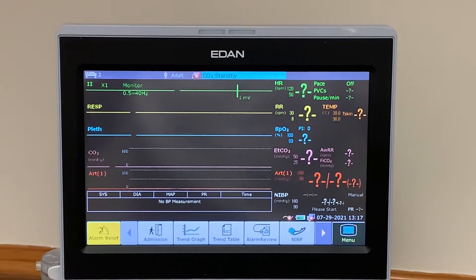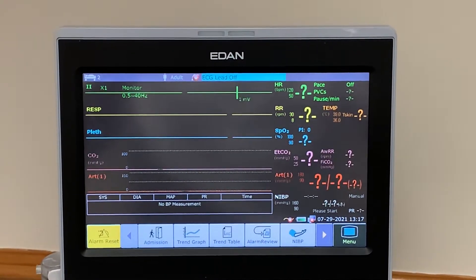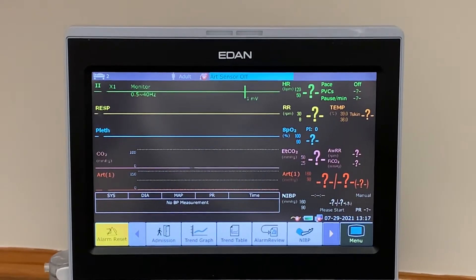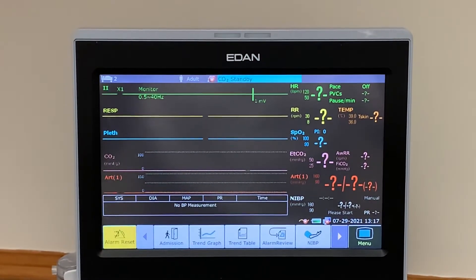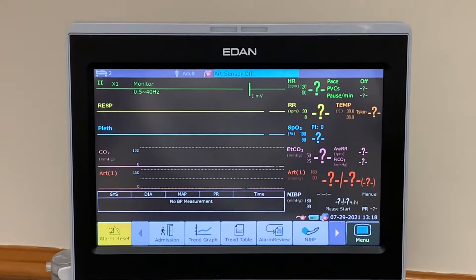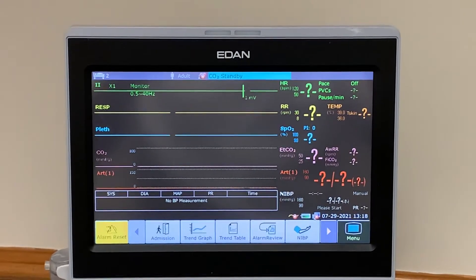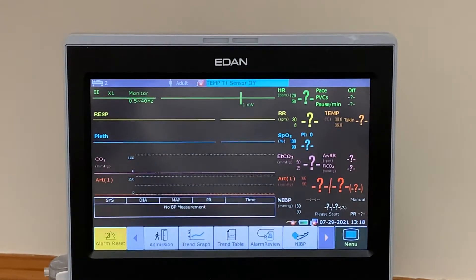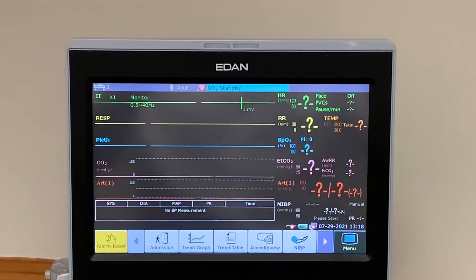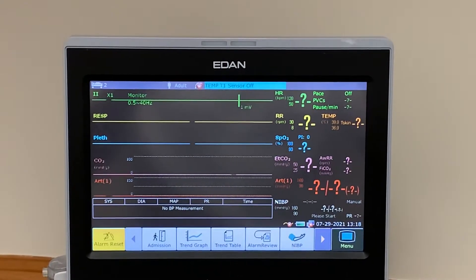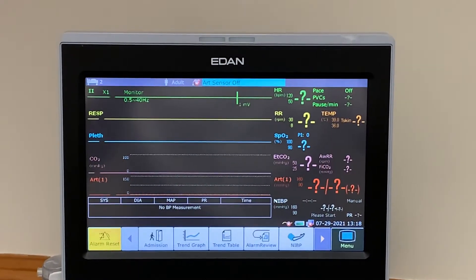Hi, this is a short video for the technicians in the hospitals that have received the COVID-19 EDAN IM50 monitors, which are configured to provide ECG, RESP, PLETH, CO2, arterial blood pressures, and NIBP. Most hospitals that have received them have wanted to remove the majority of those parameters to just leave NIBP and SPO2. I'm going to show you two different ways to remove parameters. The first way is not a permanent removal — clinicians can put parameters back. The second way is more permanent and can only be reversed by technicians.